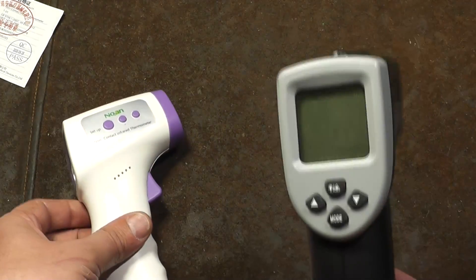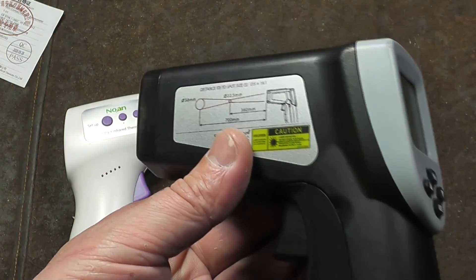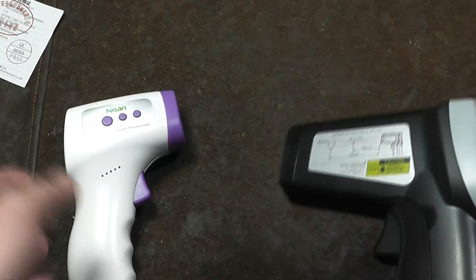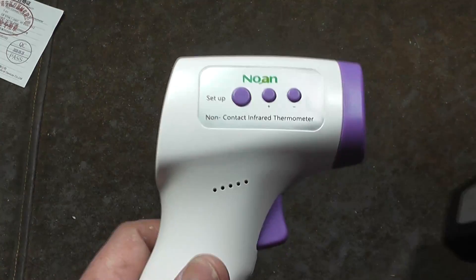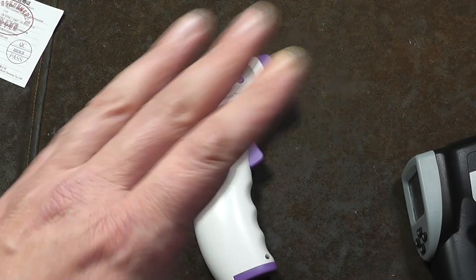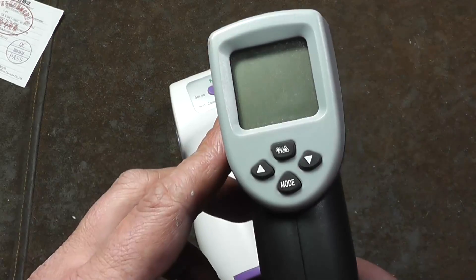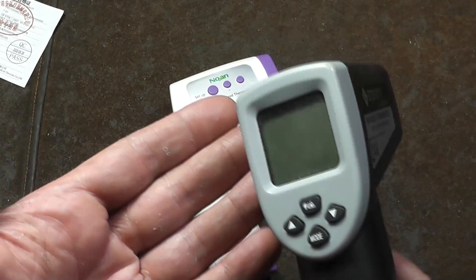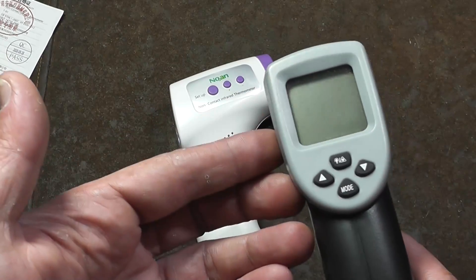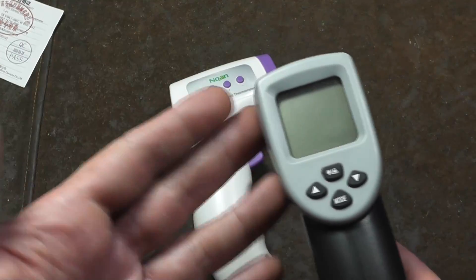This is something different versus more traditional heat guns that might be used industrially in HVAC or heating, ventilation, air conditioning contractors, general use. Even a basic one measures up to negative 40 degrees Fahrenheit, up to 500 degrees Fahrenheit. Better ones do 1000 degrees Fahrenheit. And ones called pyrometers, which are just very high temperature heat guns, go up to 2000 degrees.